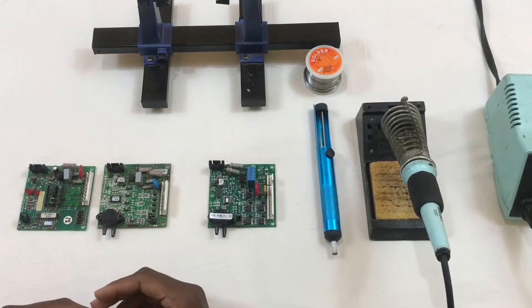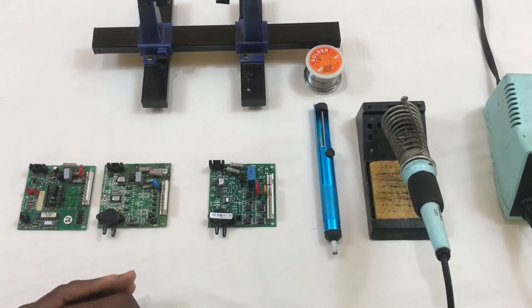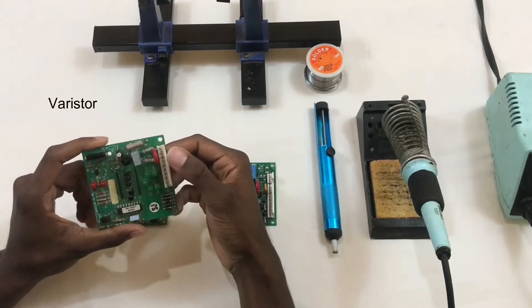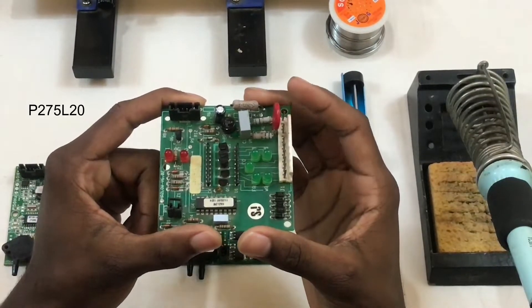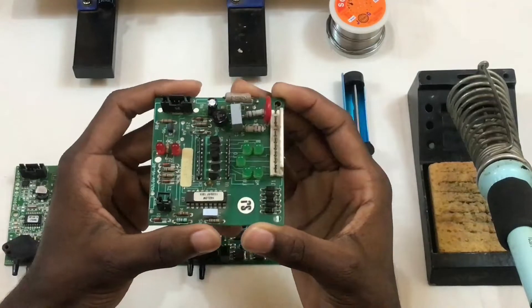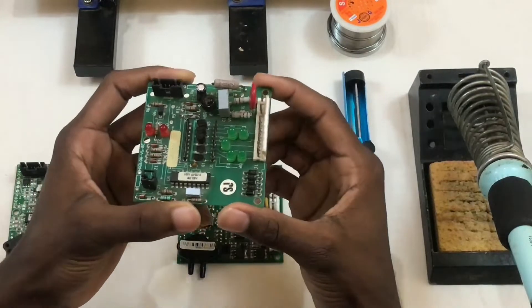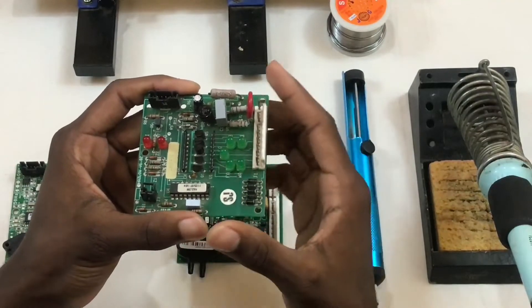Now we'll talk about the components that usually get damaged on these boards and how you can identify that they have been damaged. Most of the components that get damaged are the power supply components. When talking about power supply components, we have firstly the varistor — this red component here is a P275L20 varistor. It is mainly used to protect the board from power surges. If there's a power surge, the varistor will blow up, cutting off the current flow and thereby protecting all the other components.